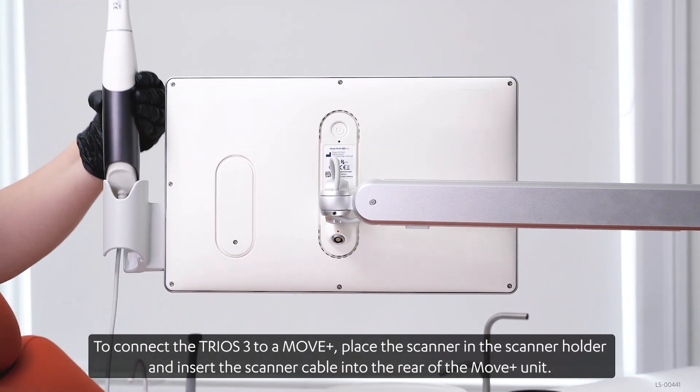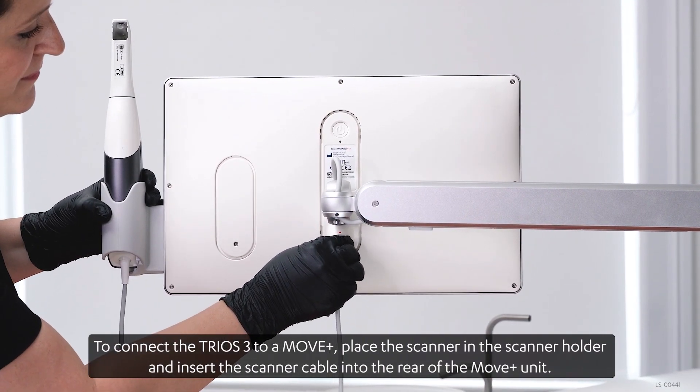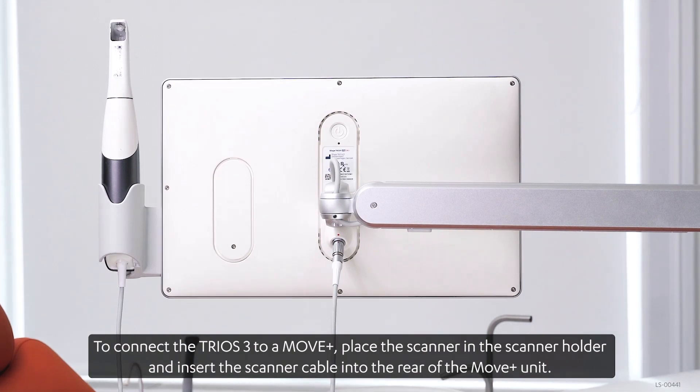To connect the Trios 3 to a Move Plus, place the scanner in the scanner holder and insert the scanner cable into the rear of the Move Plus unit.